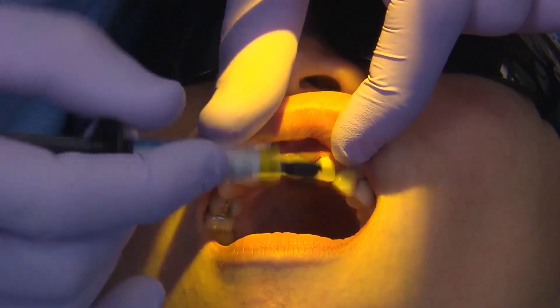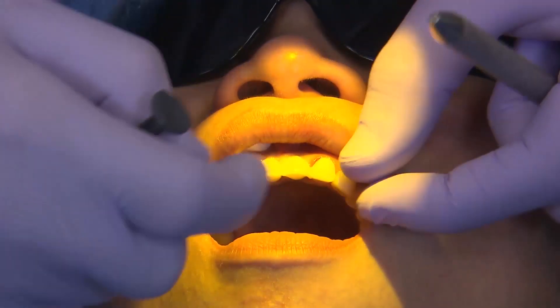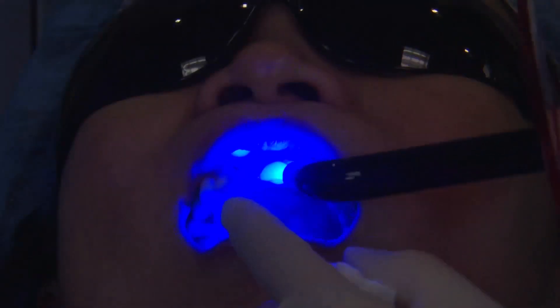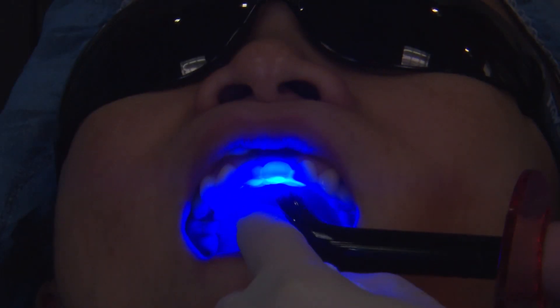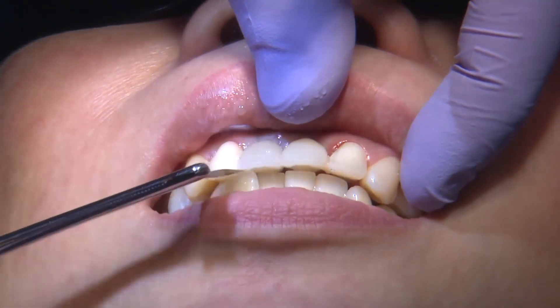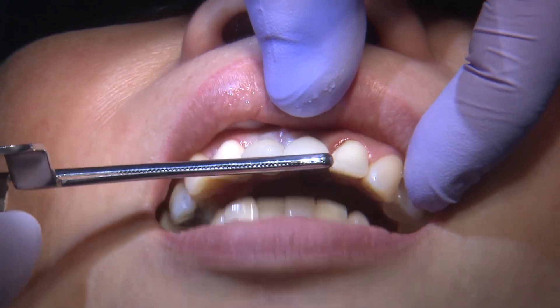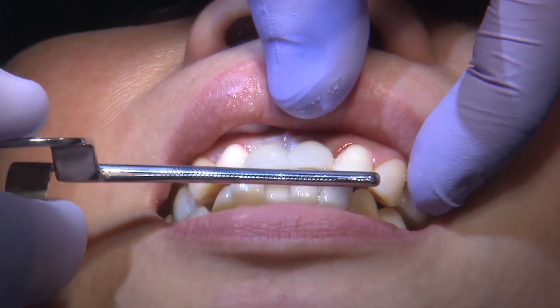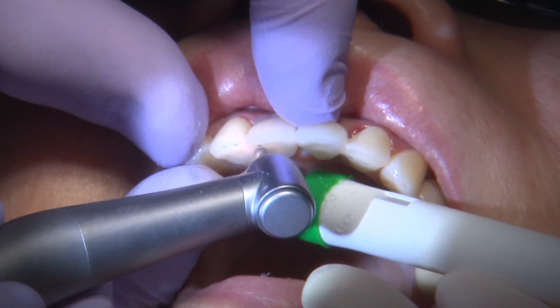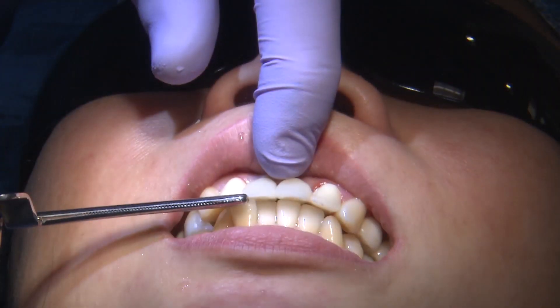Usually for a site like this in the maxillary anterior, I want those implants in place for about three to four months before I go back, remove the temporary, and start the final impression phase. I'll check the occlusion with shim stock to make sure the patient is not occluding on these restorations for both the centrals and laterals, and now we have a good view of the patient in a four-unit temporary.